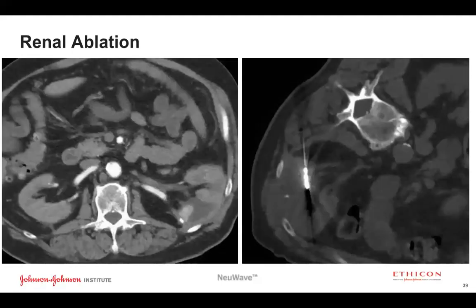Here's another situation. This is a patient that had a lesion here in their left kidney, and after treatment there was a little focus of recurrence, and they came to see me, and this seemed like the perfect lesion for microwave ablation. First of all, we want to take advantage of this oblong shape of the lesion and orient our probe along the long axis of the lesion. And again, every time I can do that, I will, especially in the kidney.